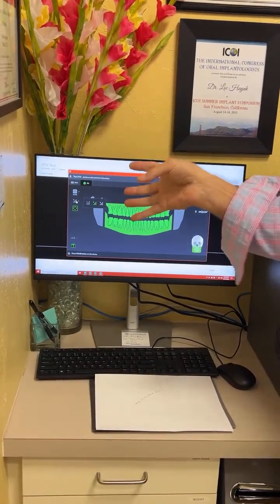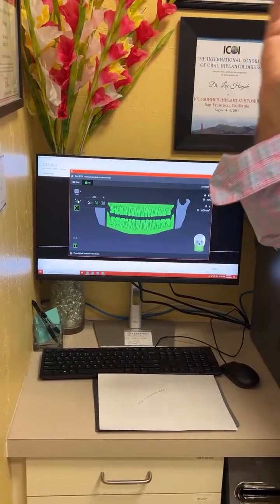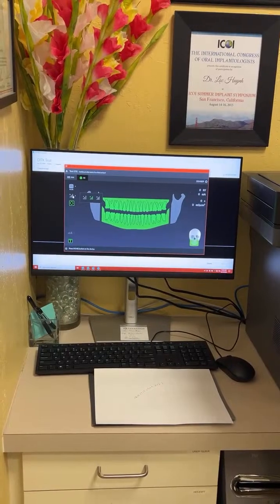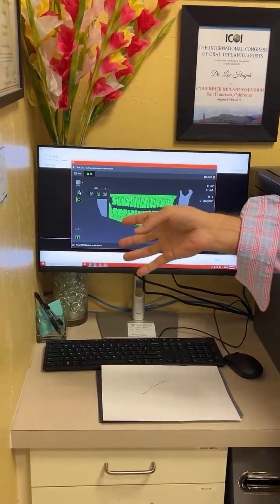But for CT, you have to look at it as what am I trying to obtain? What am I using this for? What quality do we want? What FOV do we need? Because you're affecting dose to the patient.